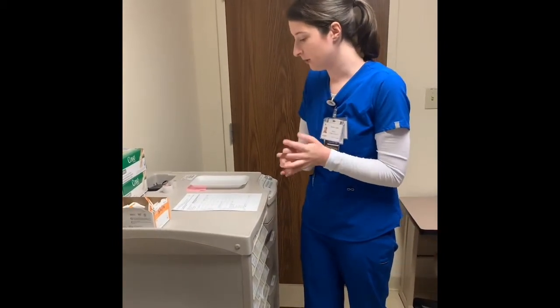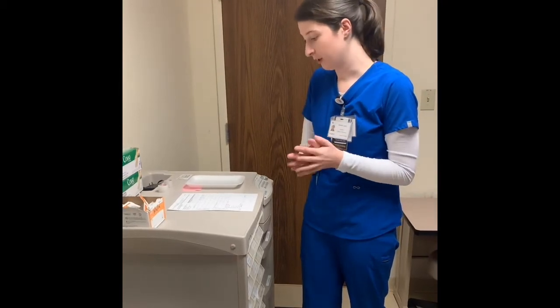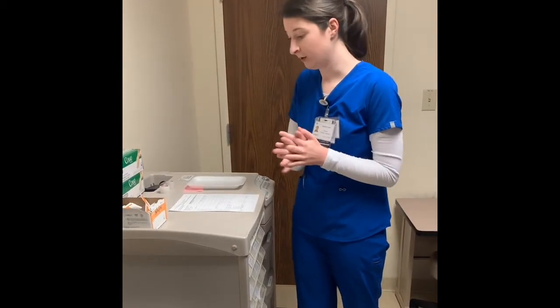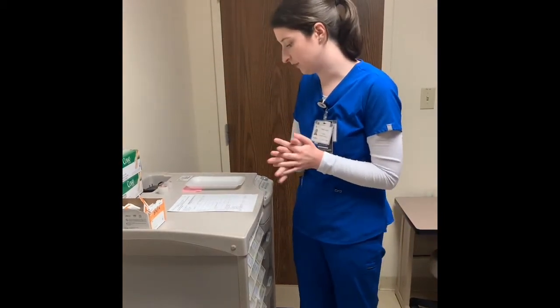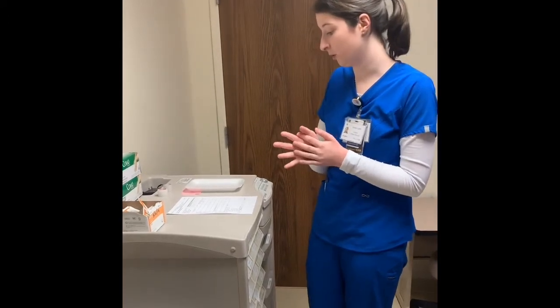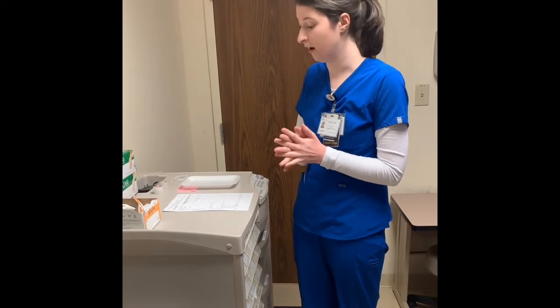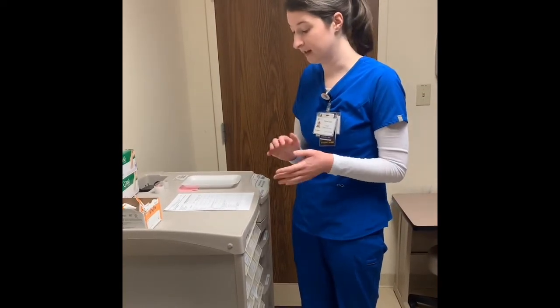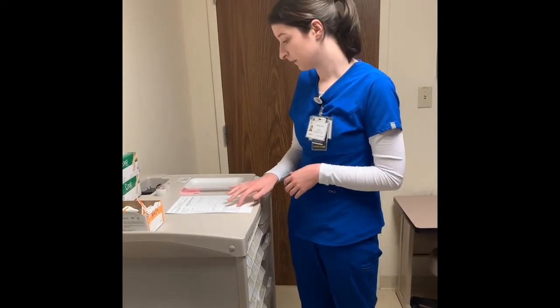Their patient ID number is 535451130. Their date of birth is 2/2/92, and he's allergic to morphine. This order is for regular insulin, concentrated at 100 units per 1 milliliter, to be delivered subcutaneously as needed based on their fingerstick blood sugar values. The sliding scale for regular insulin that I will be using is provided here on the MAR.